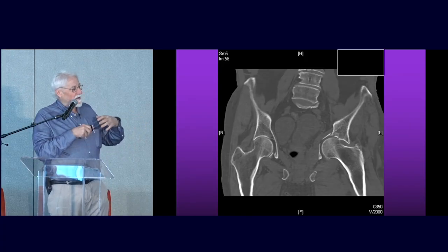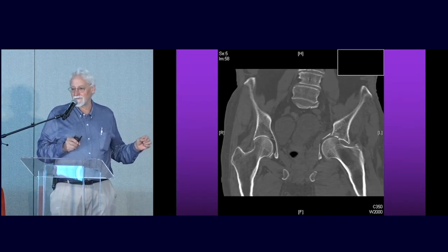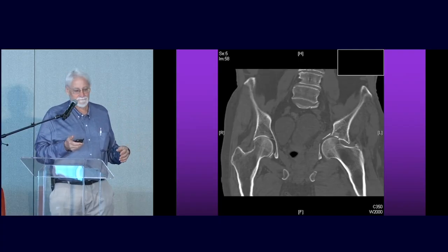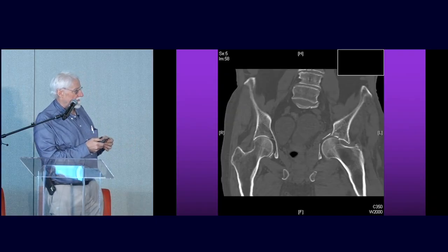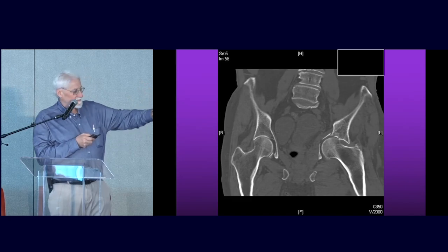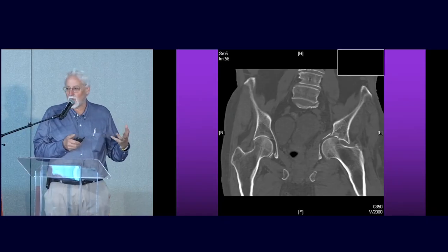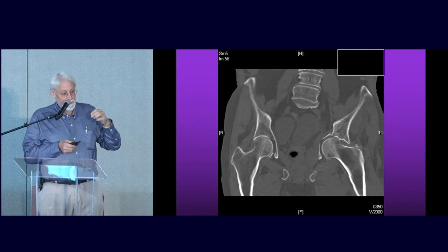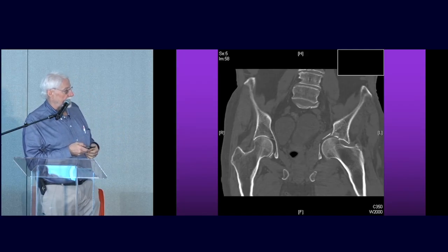They talk about the number of pieces, posterior wall fractures. Those, I think, I'm not having failures. This will be a failure in my hands almost all the time. Anybody have any disagreement with that, or everybody agree with that? And so it's always important, and this first part is going to be about these impactions. But when I see something like that, I know I can't keep it that way. I've tried everything. I've brought it down perfectly, put some calcium phosphate underneath it, ran a screw on it, that kind of stuff.